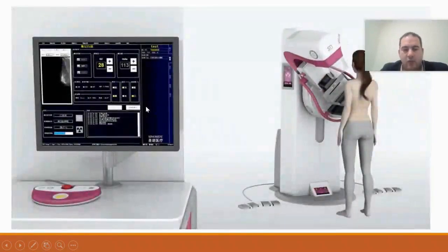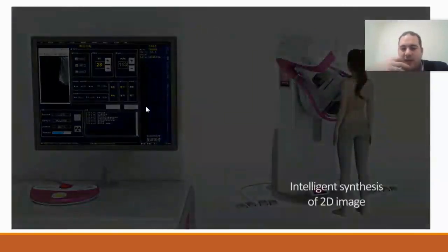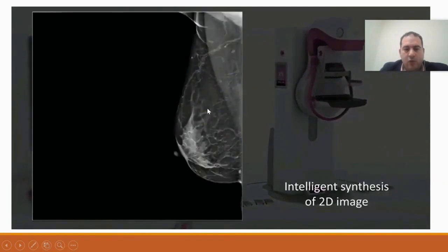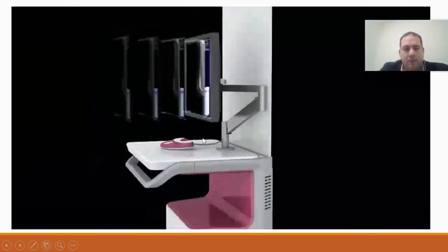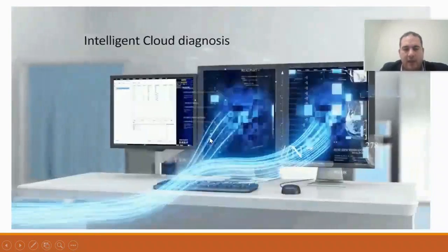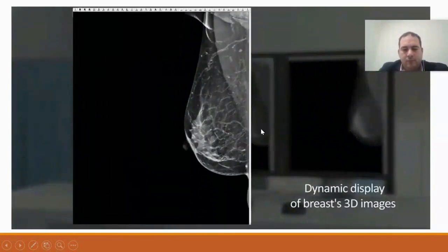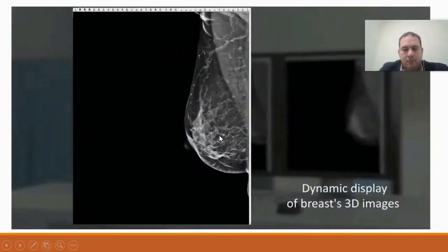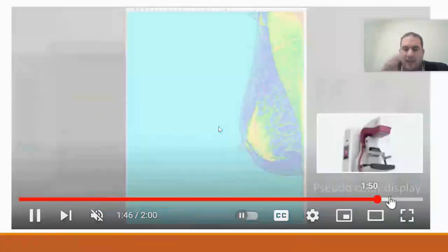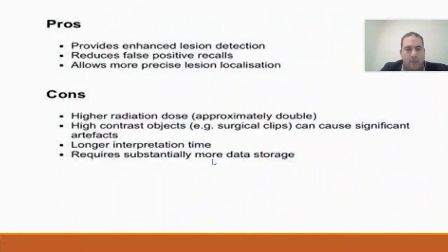The image appears in this way, and if you scroll through the images, it's just like when we were looking at CT images exactly. As it scrolls through the available images, of course, this adds to and increases the image is just right, as if you are seeing it yourself.